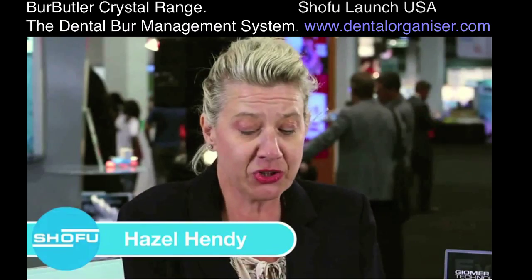Hi, my name is Hazel Hendy and I'm here to show you the new Burr Butler. It's a new innovative product supported by Shofu.